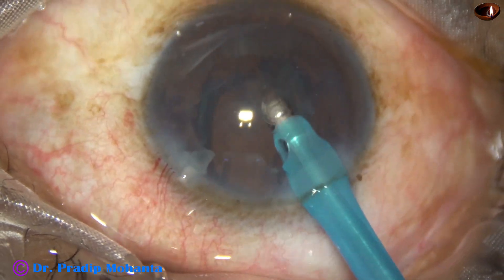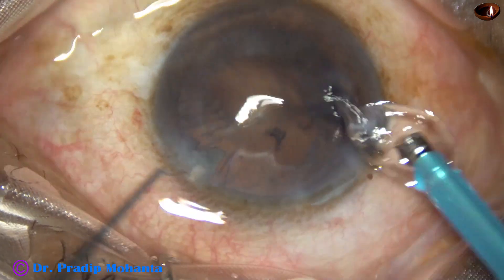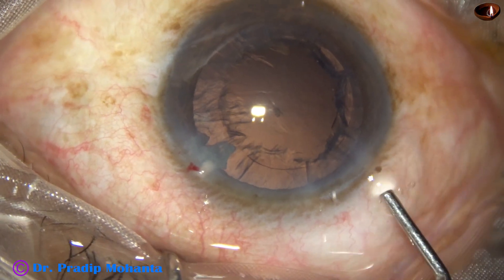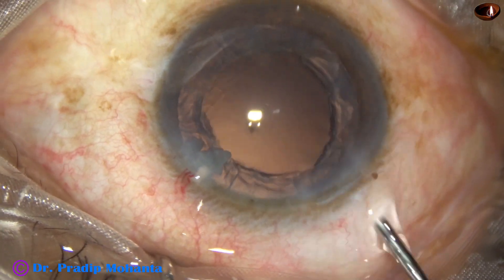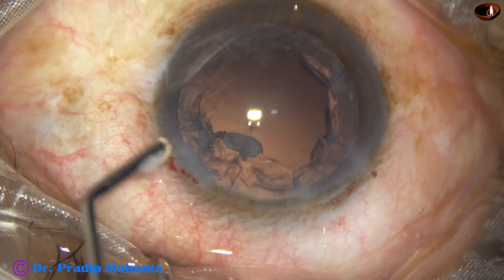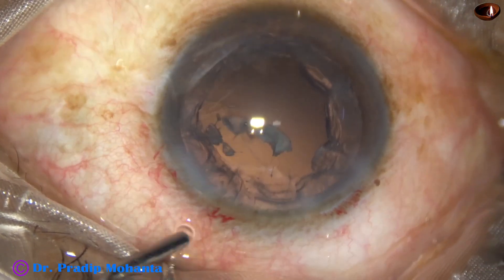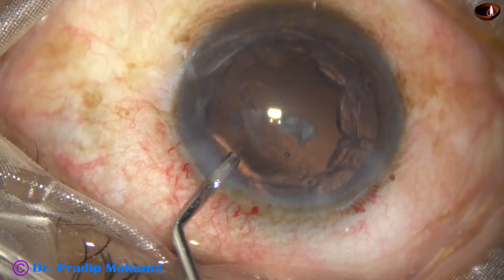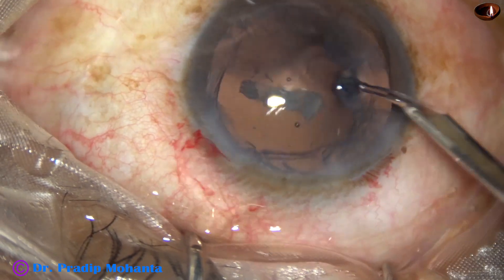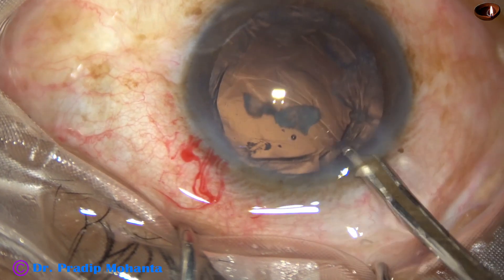The chopper has been removed so that mobility of the pieces increases. There are some small nuclear pieces at the side port. To remove those, inject some viscoelastic so that they go into the anterior chamber. We will then use the Simcoe cannula to remove these pieces through the main wound. The wound piece comes out.